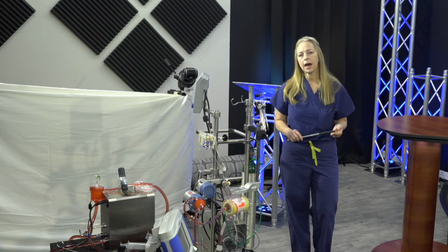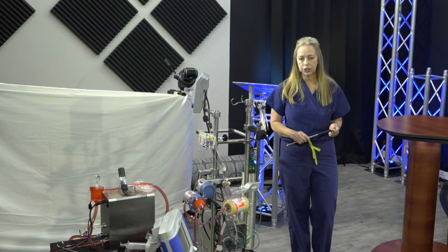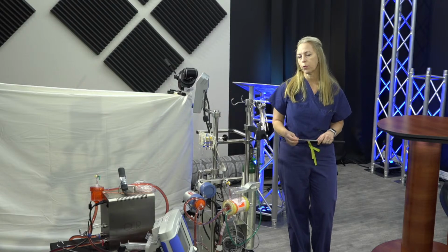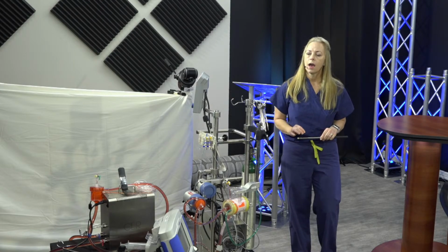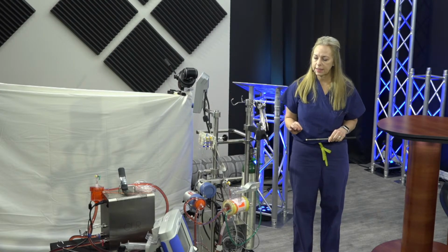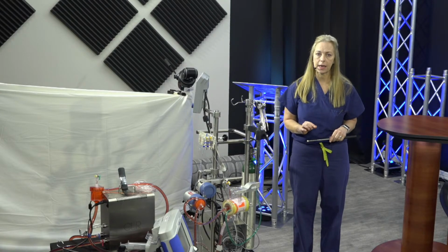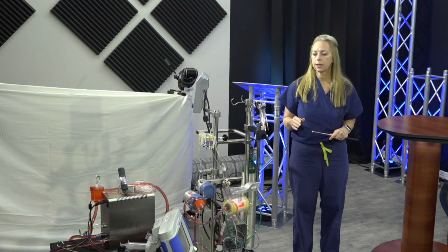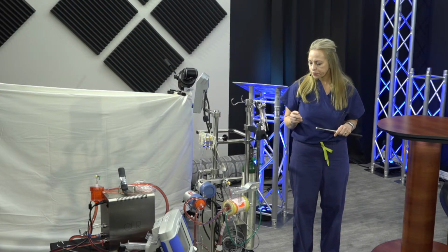Now, the reason that that is important is Joe mentioned that this device can also tell you oxygenator blood volume. And what we mean by that is, when you are sending in your saline sample, which is how you actually use the ELSA, you're going to give a saline bolus on the access side.